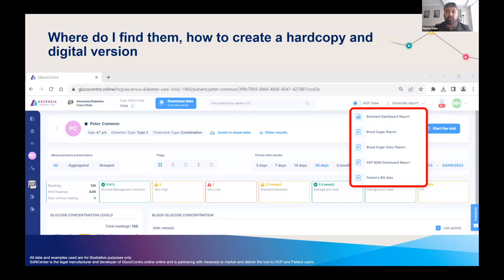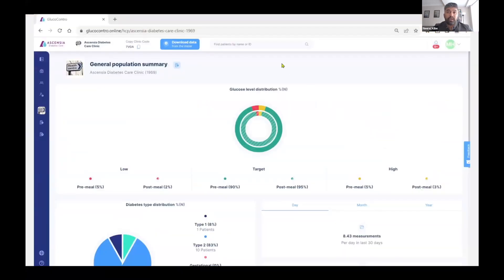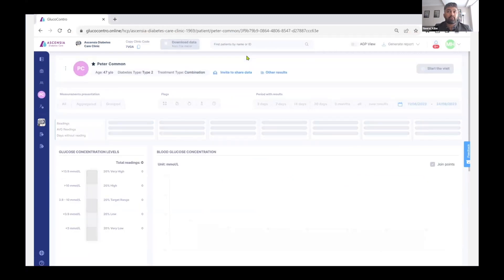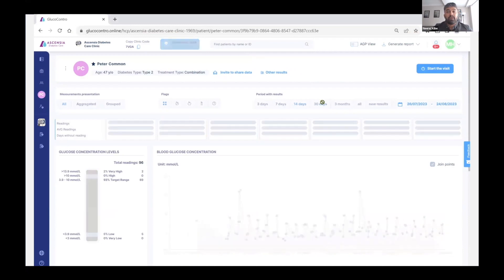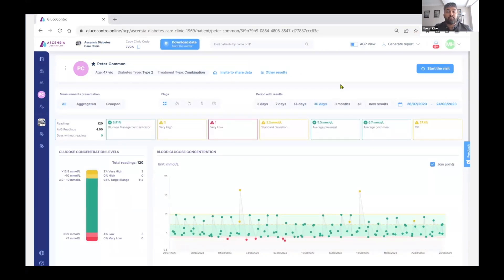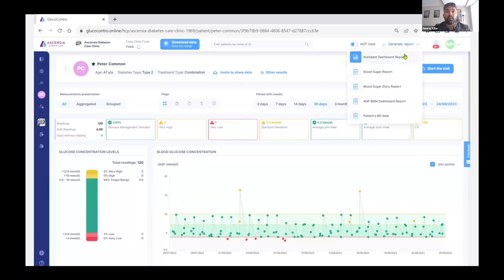To show you how this works, we've recorded a video so you can see it firsthand. Firstly, you would select your patient to bring up their profile. The report outputs are based on the filters and timeline selected at the top of the page. Therefore, if we wanted the report to cover the data for the last 30 days, we would select this time period. The generate report button is located in the top right of the banner, and clicking it brings down the drop-down menu of the five different reports. For this example, let's select the first report.